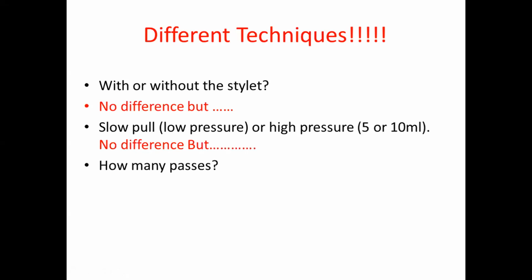How many passes? At least 3 passes. If you don't have rapid on-site evaluation, then you should do at least 3 passes.